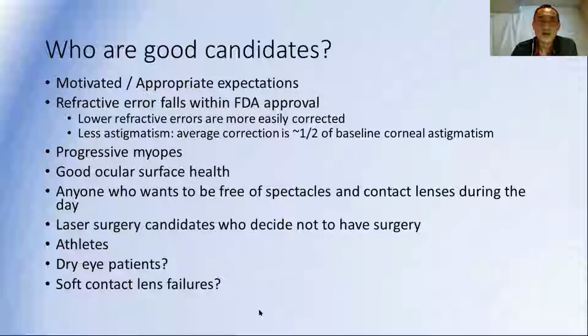When they're in college, are they sleeping long enough to continue to wear the lenses so that they're effective? Some yes, some no. But minimum, I would say 18 years old is when they can stop if their concern is myopia control. Otherwise, they can continue on indefinitely.